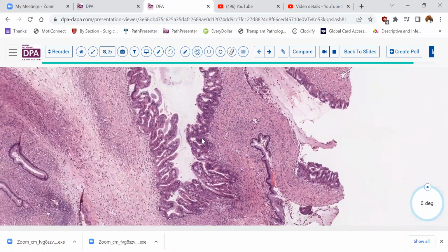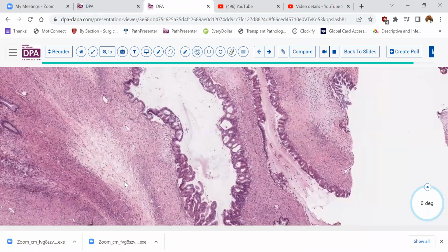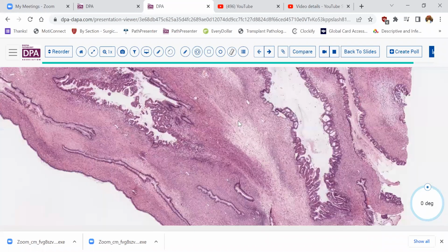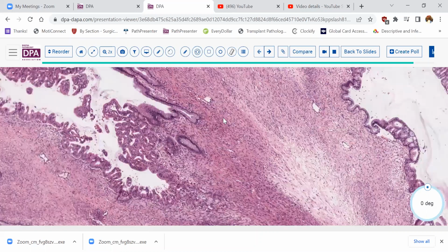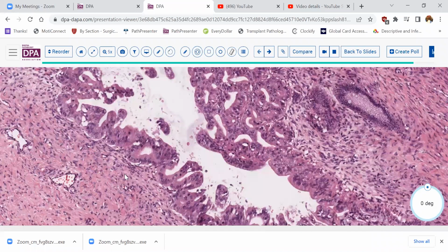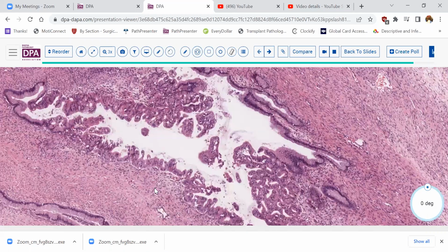Or as I would say at frozen section, at least borderline, because obviously sampling is very key in these lesions. And most of the areas that we're looking at here are borderline areas. You have more complexity and you certainly have a degree of atypia, that is a cytologic atypia that would suggest a borderline neoplasm.